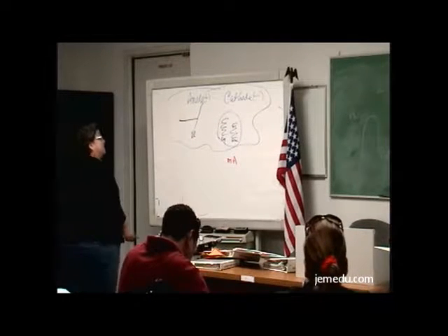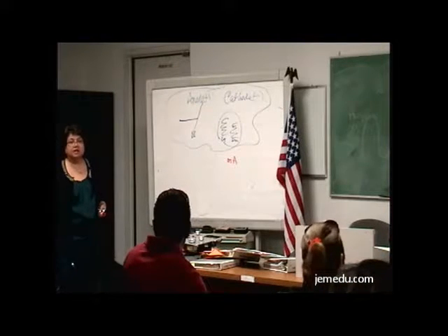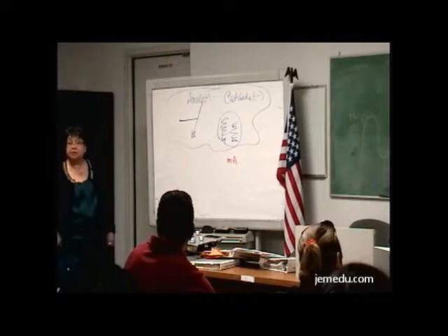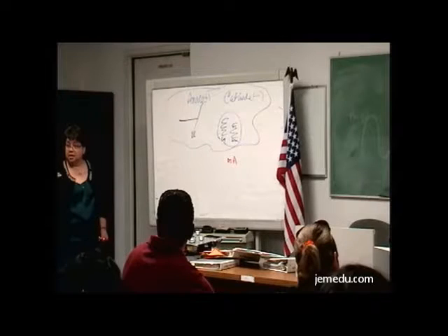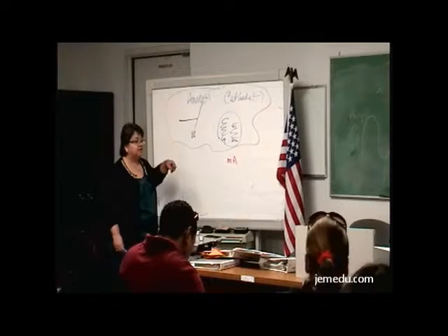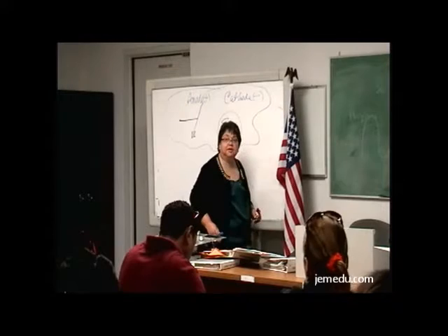Now we have that glass in there. Why do we have glass? What was the big reason about having glass around it? Because we used to have tubes without glass around it. Franklin sure didn't have glass around his X-ray tube. Why the glass now? We want to keep a vacuum, want to make a vacuum. So we're going to suck out all the air. We're making this a vacuum tube. Why do we use a vacuum?